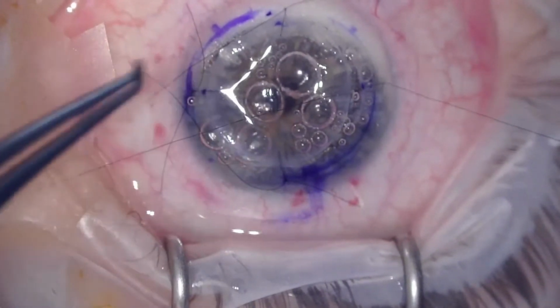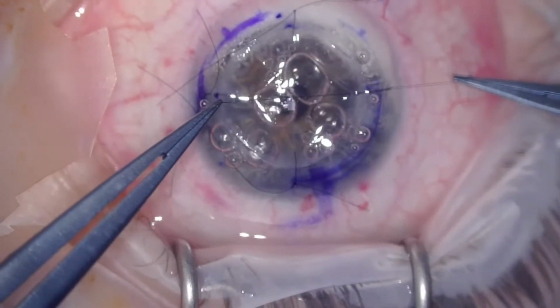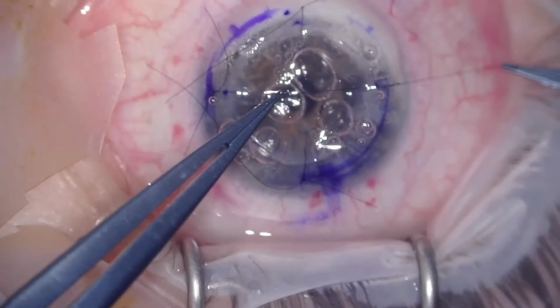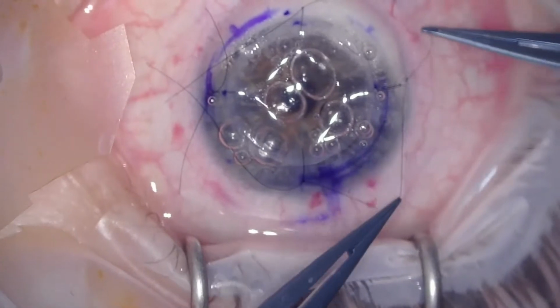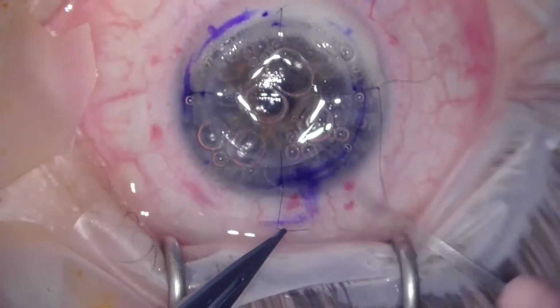I'm trying to make the sutures as equal to each other as possible, but it's sometimes quite challenging when you're doing the cardinals because you're working with a graft that's moving around a little bit. It's not secure onto anything. So here I'm adjusting the tension. I'm trying to look for the diamond. I'm trying to look for the behavior of the 9 o'clock and the 6 o'clock sutures. If they're being dragged over too much, you know that that cardinal is too tight.